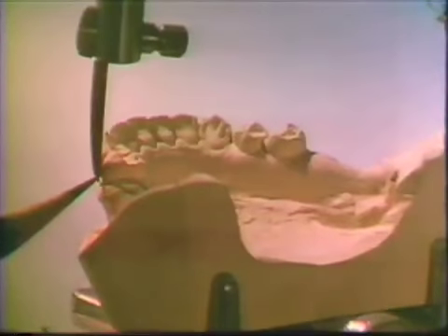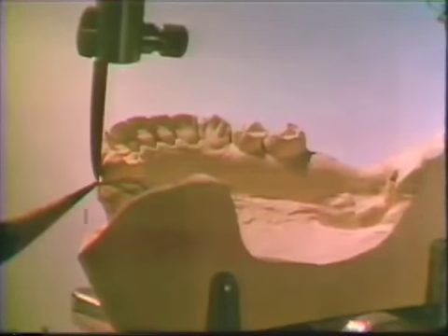When all data has been recorded from the articulated study models, the diagnostic cast is then transferred to the dental surveyor for further detailed observations. Those teeth which may support the prosthetic appliance must be examined for contours that will permit proper clasping.